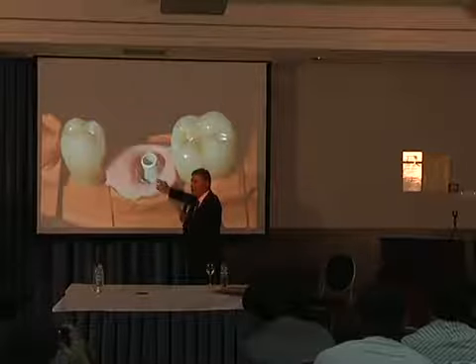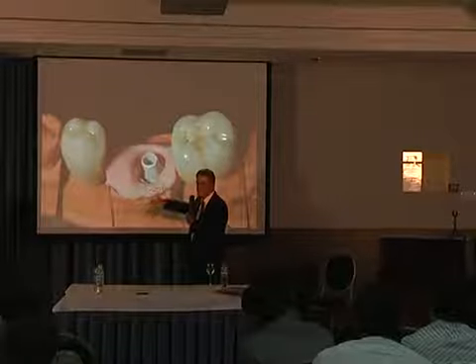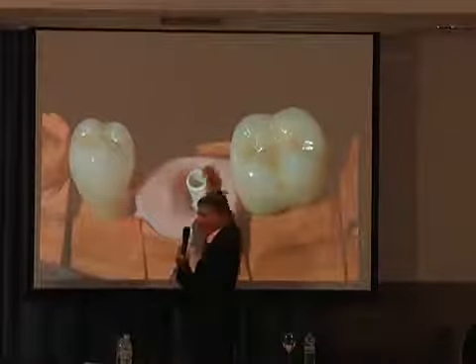This is an ideal indication for an emergence profile abutment, a customized CAD-CAM emergence profile abutment, because small implant, big gap.